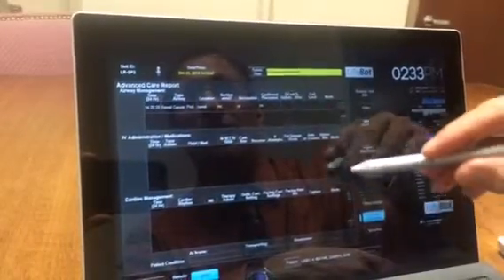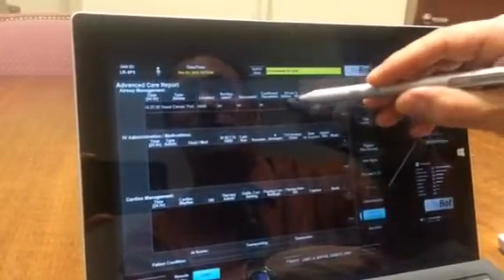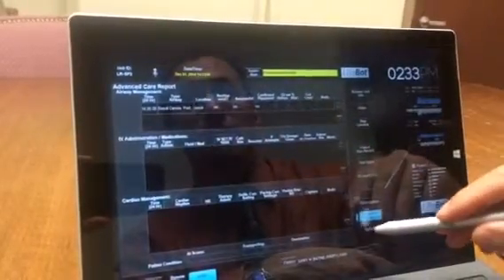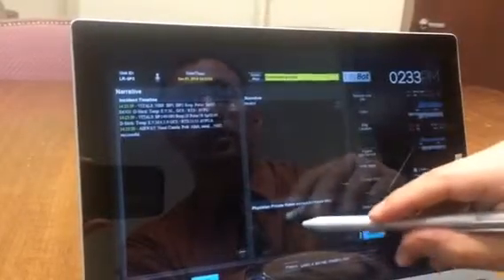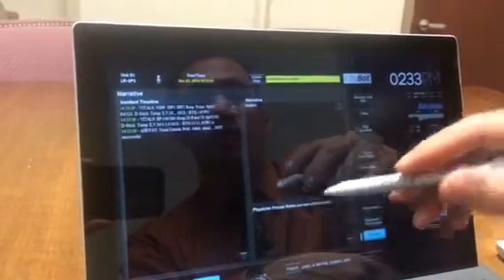They will have put in any treatment modalities, treatments that they have given. In this case, patient received nasal cannula, oxygen. And then, of course, the narrative, which will have the vital signs that were taken. You can actually put in notes into LifeBot.